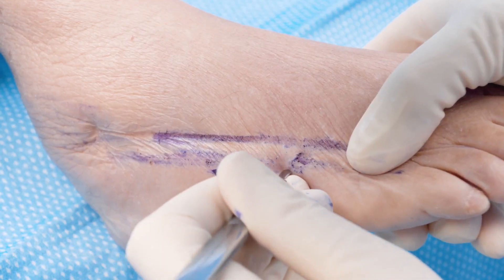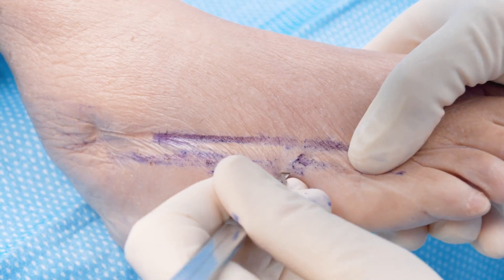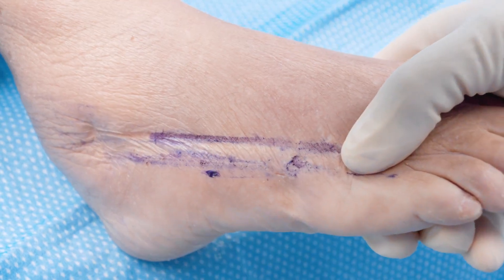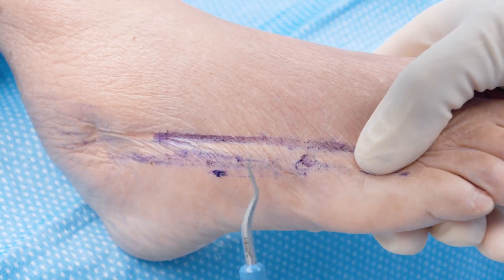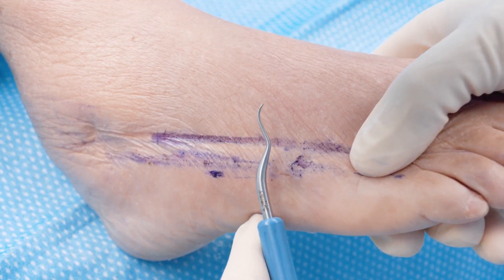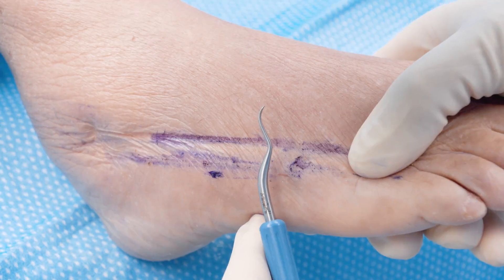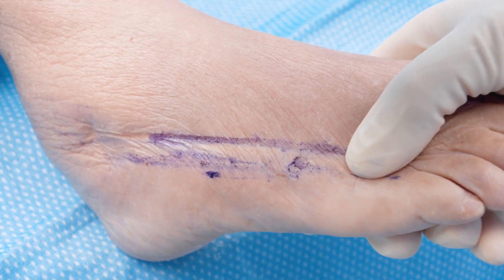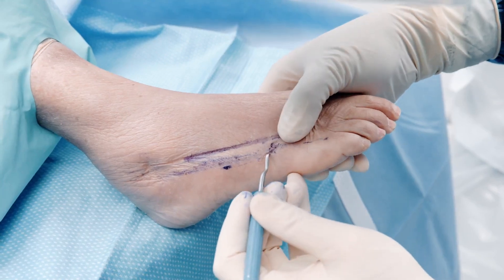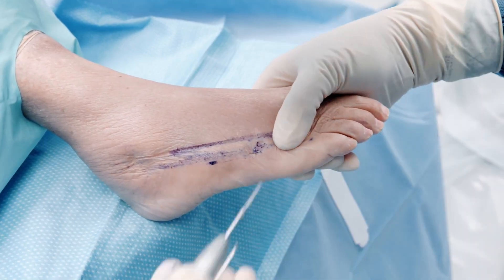We're going to make our incision. I will typically make the incision directly lateral, and that will allow me to do a long oblique osteotomy. I'll use my little elevator — it has the ideal curve to minimally elevate the periosteum dorsally and planarly to minimize soft tissue disruption while allowing enough exposure.